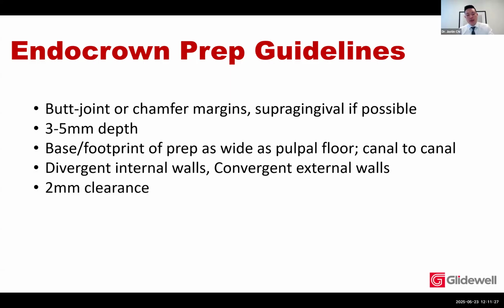The amount of occlusal clearance: because we really want ultimate strength in these restorations, adequate material thickness, we're looking to establish, if there is coronal tooth structure left, about 2 millimeters away from the opposing for optimal thickness, and of course, that leads to optimal strength.